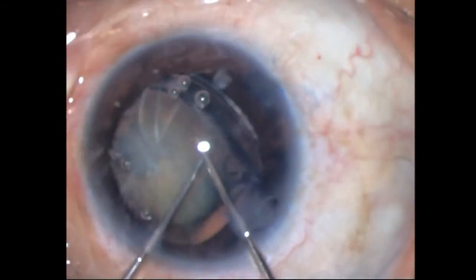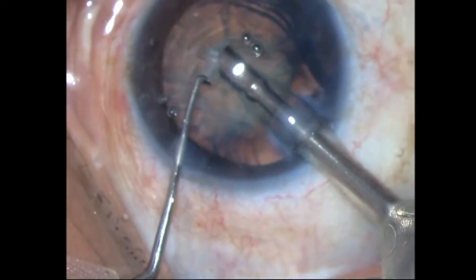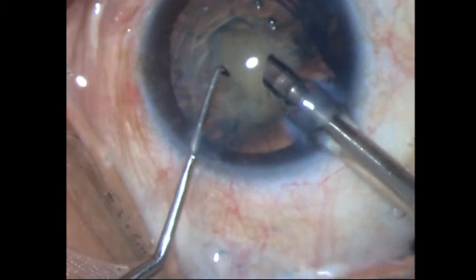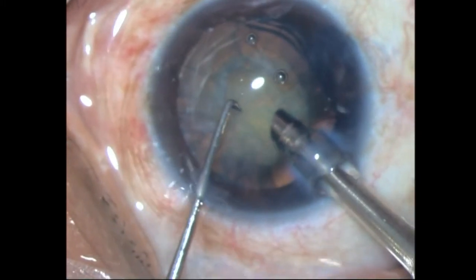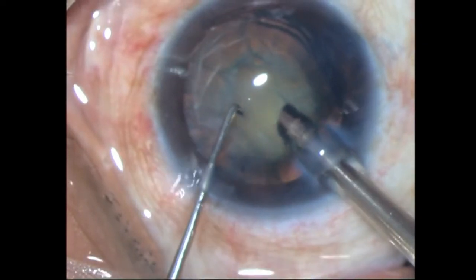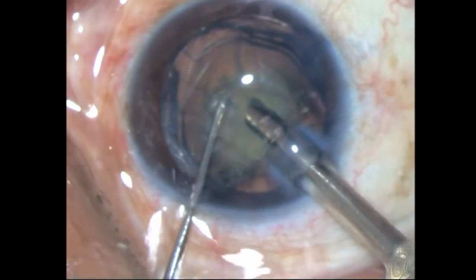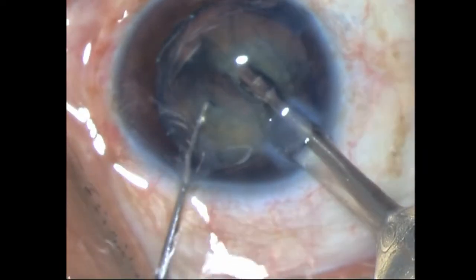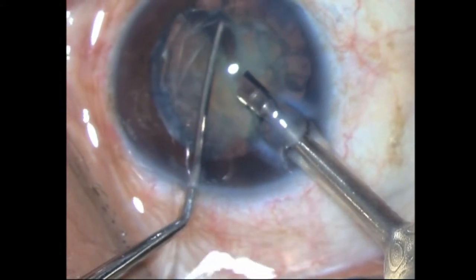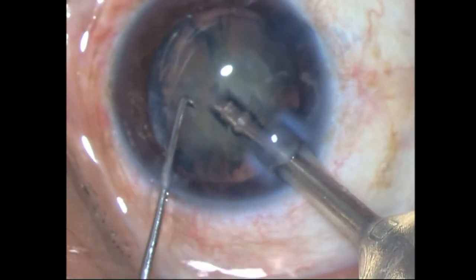With the CTR in, it's time to phaco. This is unfortunately a pretty significant cataract — it's not going to be a cakewalk. I've gone in with my sharp chopper and my 2.2mm phaco tip at around 60% phaco power, trying to do the quick chop method. I've got the first chop. The problem will be rotation — because of the weak zonules it's going to be very difficult to rotate, so I'm trying to get a small piece first.